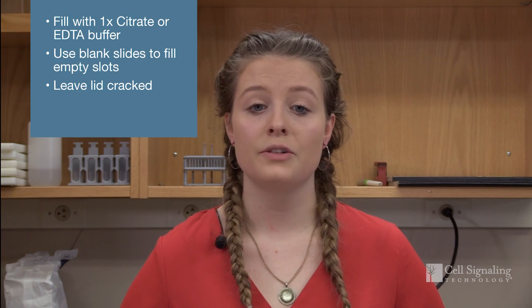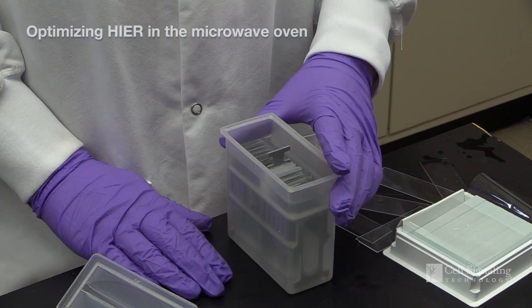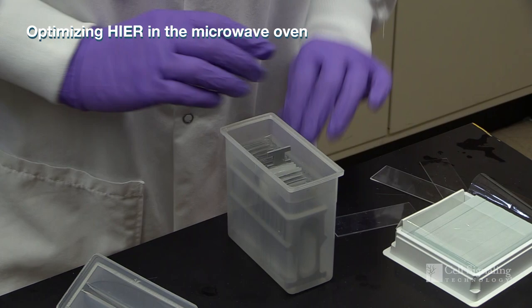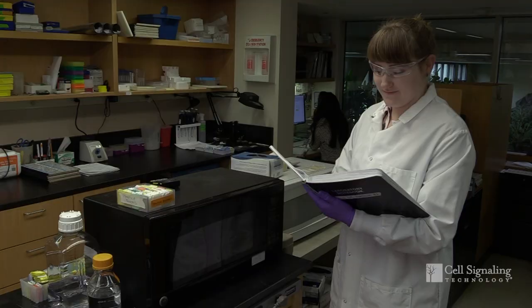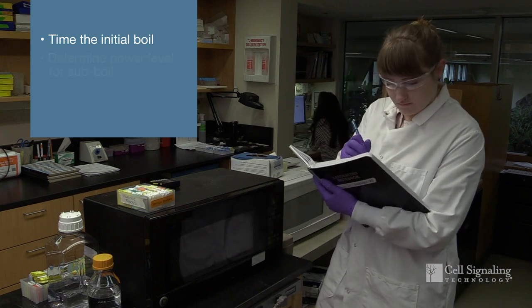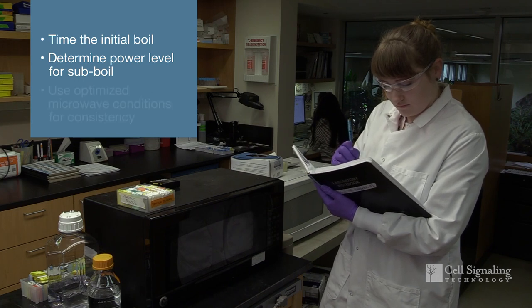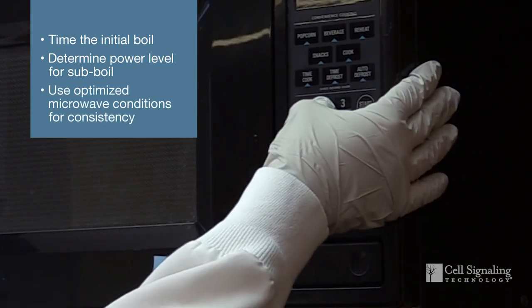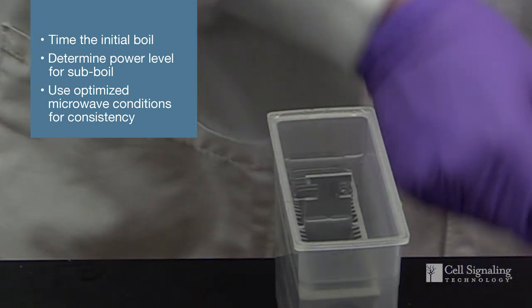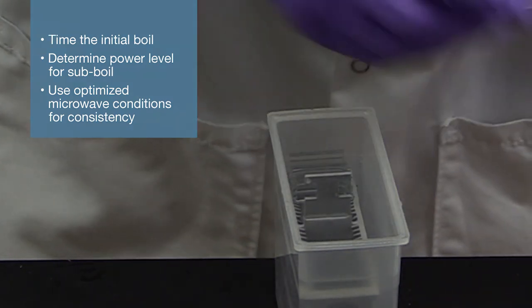A common misstep in antigen retrieval is aggressive boiling, which can cause tissue to detach from the slide. To optimize microwave time and power, we suggest performing a trial run. Use 24 blank slides in 250 mL of buffer and determine how long it takes to reach the initial boil. Next, determine the power level needed to maintain a sub-boiling temperature for 8 to 10 minutes. Once you have established the conditions for your microwave, perform the retrieval the same way each time, always using the same amount of buffer with empty slots occupied by blank slides.